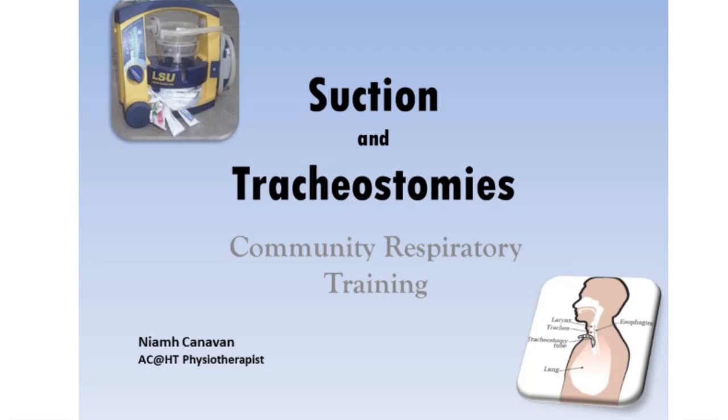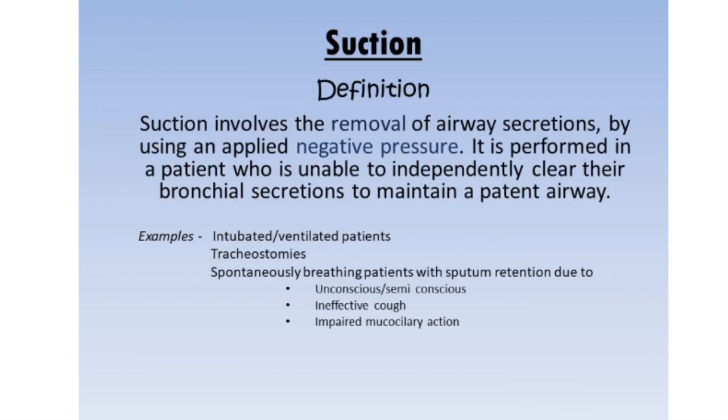So my presentation today is covering suction and tracheostomies, and this will be immediately followed by practical demonstrations. So suction then is defined as the removal of airway secretions by using applied negative pressure. It is performed in a patient who is unable to independently clear the bronchial secretions to maintain a patent airway.